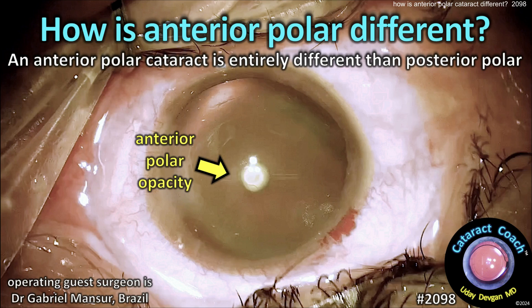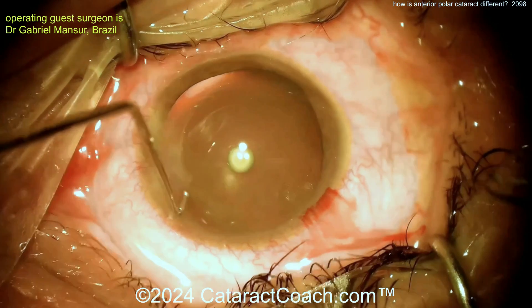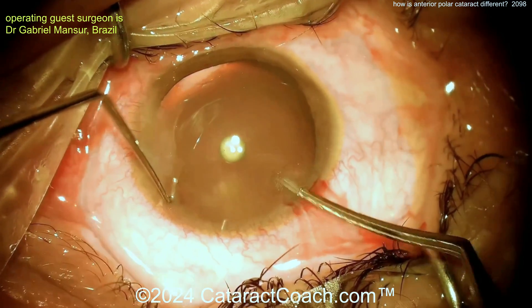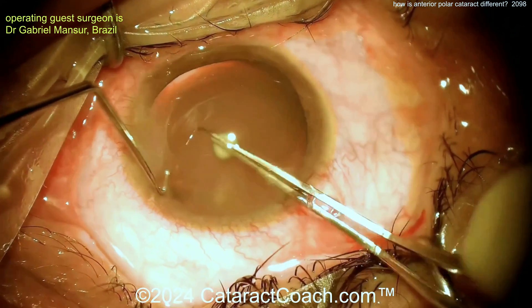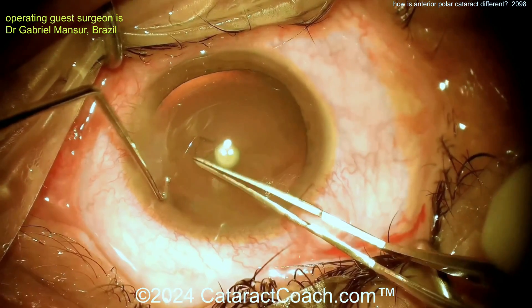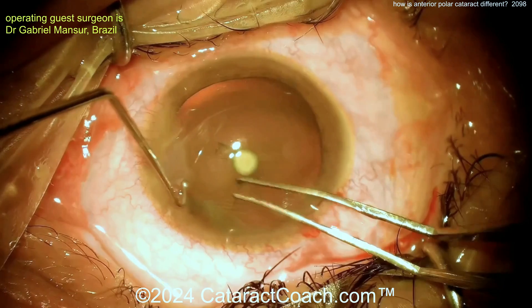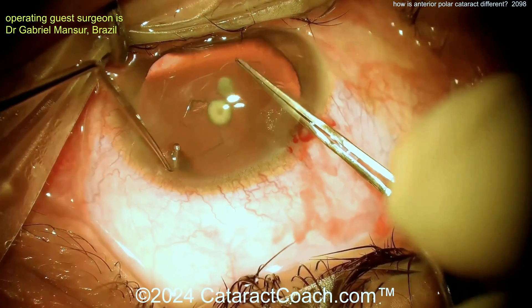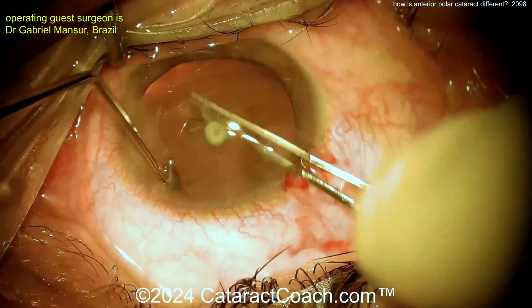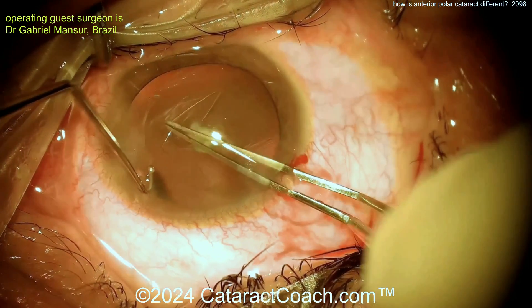How is an anterior polar cataract different? We talk all the time about posterior polar cataracts — there are dozens of videos of that on Cataract Coach. Anterior polar is this polar opacity on the anterior lens capsule. The posterior lens capsule is obviously far more important because that's very fragile, and at the site of a posterior polar opacity, you can have a break in the capsule very easily.